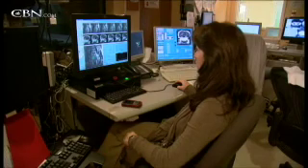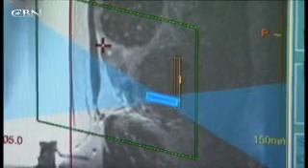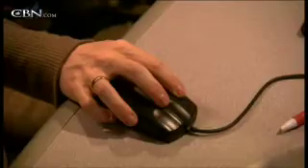She's inside the MRI monitor with the ultrasound device below her. LeBlang directs the entire process from an outer control room. The dark area is one of the fibroids, while she makes preliminary adjustments to the beams. We went up much higher on the energies, so this one should be getting more therapeutic dose now that we know we're getting where we want it to go. We know the machine's calibrated right. Then she fires away, blast after tiny blast.